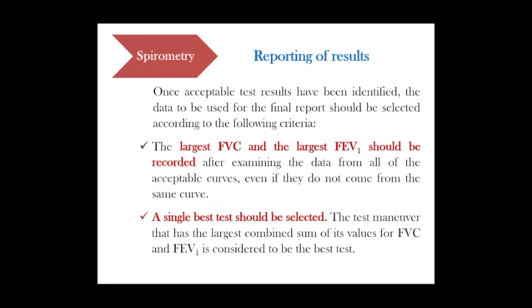If we talk about reporting of results, once acceptable test results have been identified, the data to be used for the final report should be selected according to the following criteria. The largest forced vital capacity and the largest forced expiratory volume in one second should be recorded, after examining the data from all of the acceptable curves, even if they do not come from the same curve. A single test should also be selected, which is the test maneuver that has the largest combined sum of its FVC and FEV1 values.